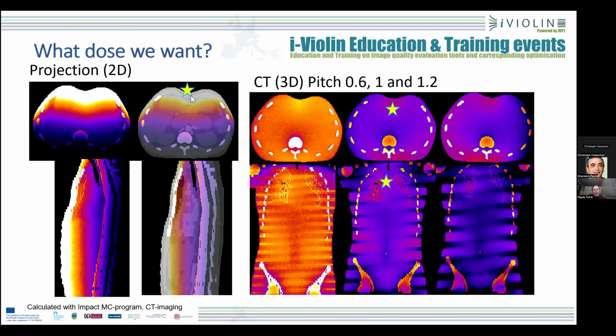So we only estimate or calculate or measure the dose which is entering the patient. But you can see that actually the dose distribution inside the patient is varying quite a lot. So it's not representing patient dose at all. It's just this kind of technical parameter. And if you want to estimate the patient dose, we need to do many steps before we can actually have the organ dose in our hands.